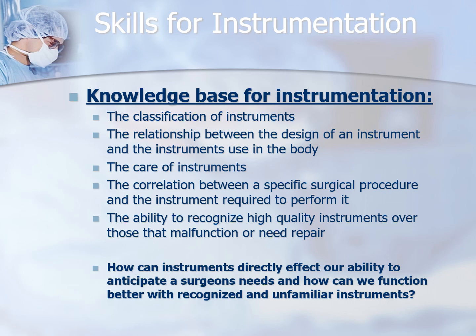those situations so that those things don't get passed on to the surgeon, and so that we communicate that to sterile processing so they don't get back to the surgeon on the next case. Because nothing's more frustrating for a surgeon to be using some special instrumentation and one's malfunctioning, and then he or she gets that same malfunctioning one for the next case. We want to make sure that we try our best to avoid that.